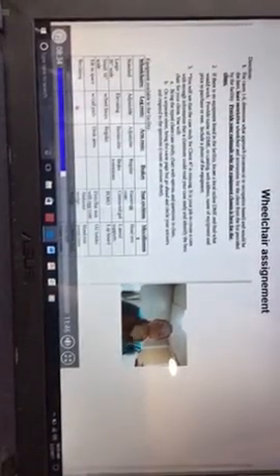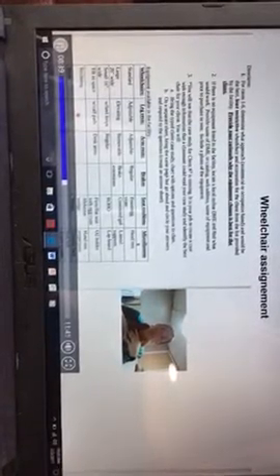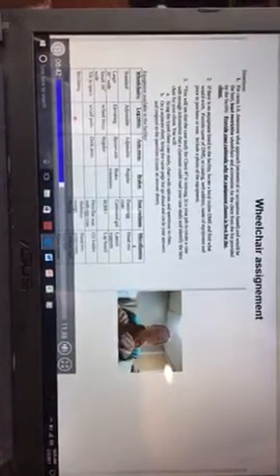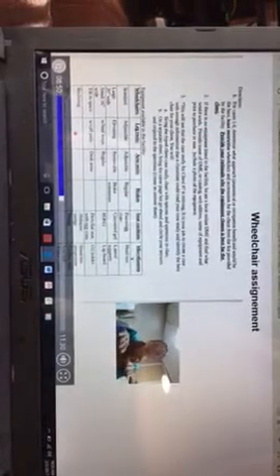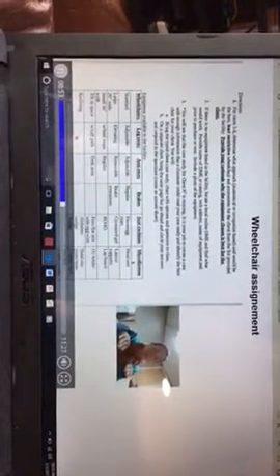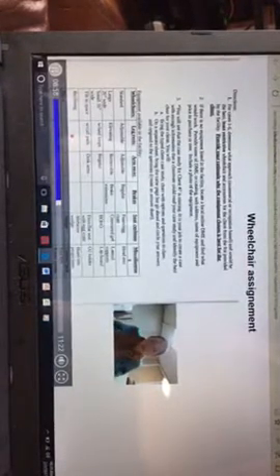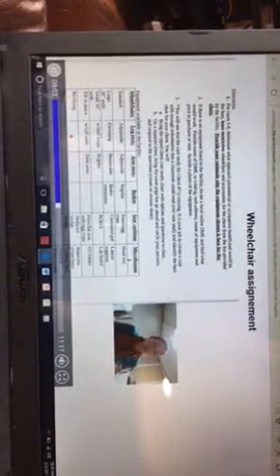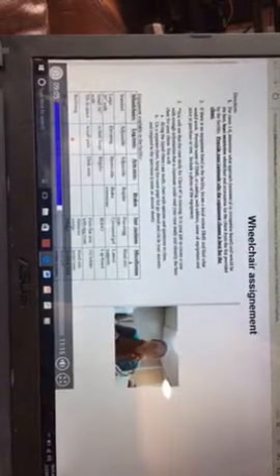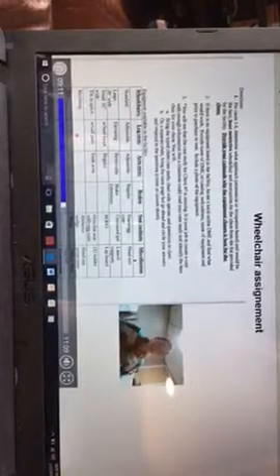The firm flat seat with a crate. Okay, so if you have somebody who has a lot of obliquity in their hips, so like your hips should sit kind of equal. Well, some people tilt a little bit like this, or they tend to lean to the side. If you want to even those hips out a little bit, putting something firm and flat underneath an egg crate will help to stabilize their hips. You still get a little bit of that with that contoured gel cushion also, because that foam underneath the gel is thick enough that it really helps to even out the hips into a more regulated sitting surface.